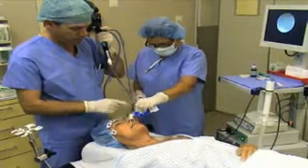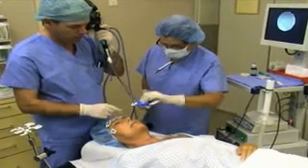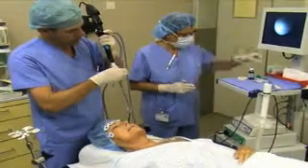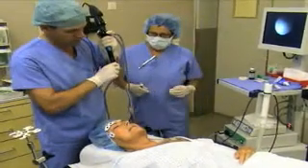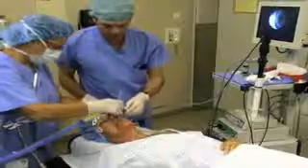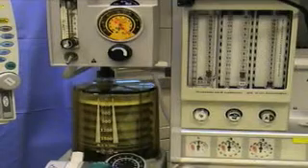Place lubricant at the nasal orifice and on the cuff of the tube. Advance the tube using rotating movements. You may sense a slight resistance at the beginning of the nasal passage. Watch for the appearance of the tube on the screen of the fiber optic unit and place the tip of the tube 3 to 4 centimeters above the carina. Remove the fibroscope and attach the tube to the ventilation system of your anesthesia machine.